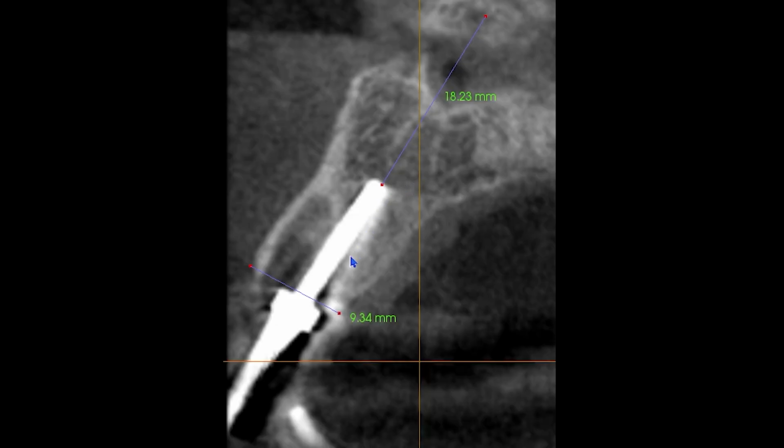Now here's a guide pin shot. On a guide pin shot, you do not want to go into the extraction site and go right out the apex, because you're also going to go right out the buccal, because they're almost always buccally situated. God gets away with that. We don't. So you're always going to come up the lingual wall and put it in here. And I tell everyone for the guide pin shot, try and stay nice and safe. Stay right in the middle, and then you can change the angulation subtly after that with just a little bit of hand pressure, as you're going to see with the final restoration.